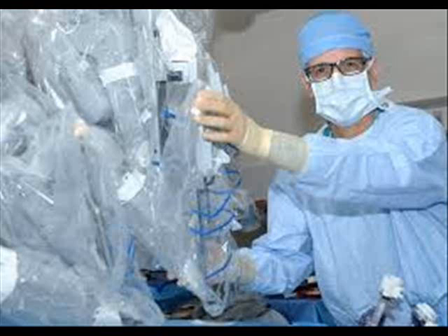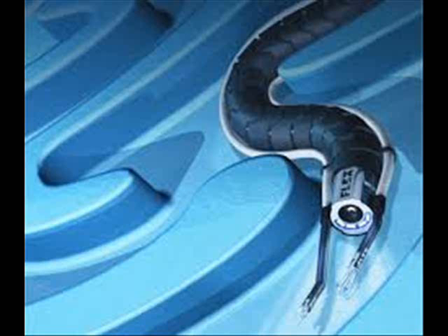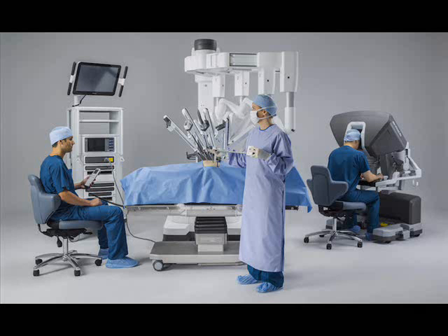Gynecology. Robotic surgery in gynecology is of uncertain benefit, with it being unclear if it affects rates of complications. Gynecologic procedures may take longer with robot-assisted surgery but may be associated with a shorter hospital stay following hysterectomy. In the United States, robotic-assisted hysterectomy for benign conditions has been shown to be more expensive than conventional laparoscopic hysterectomy, with no difference in overall rates of complications.